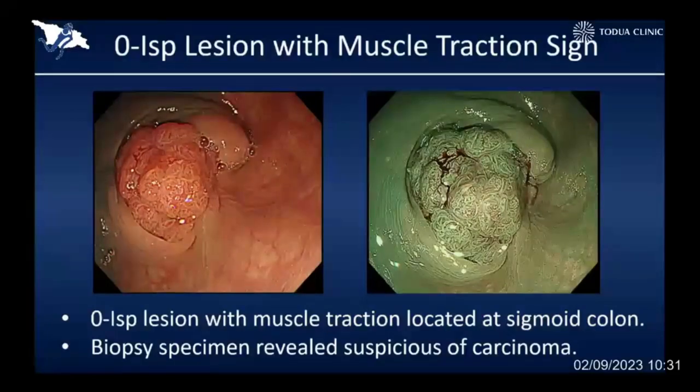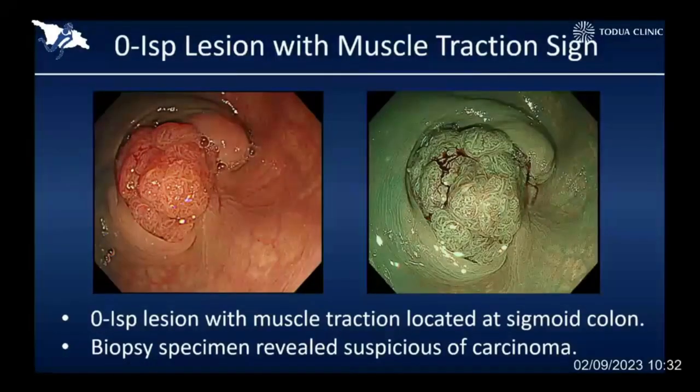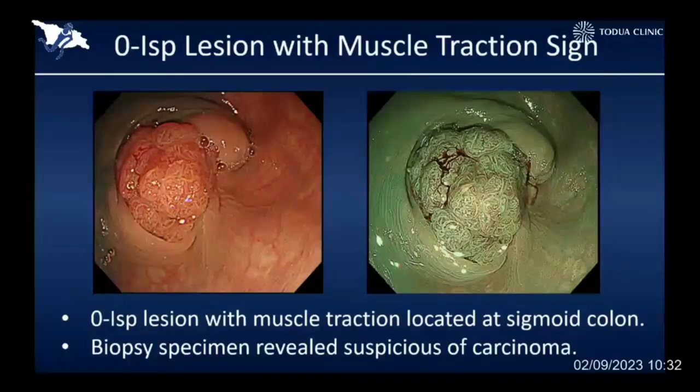Another challenging situation is, again, severe muscle traction sign. As you can see, this is a big polypoid lesion occupying the entire lumen of the sigmoid colon, and there was severe muscle traction sign. Therefore, we suspected this was already invasive cancer. But unfortunately, biopsy could not prove the cancer cells. Therefore, this patient refused surgery, and our surgical colleague asked me to do endoscopic resection partially for diagnostic purposes.